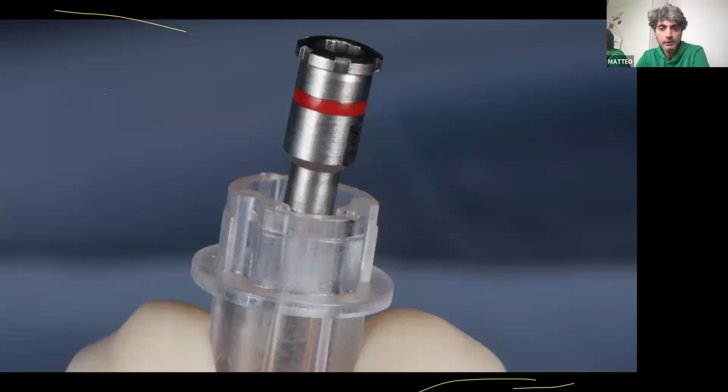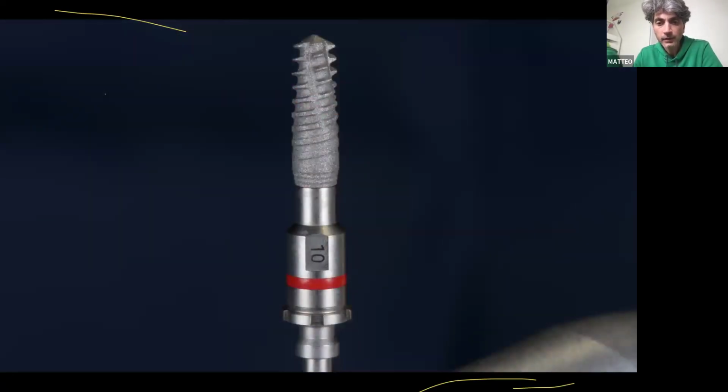Now, here we're using the stabilizer. So you put the stabilizer, you catch the implant, and then you have to screw. There's a screw inside. You need a screwdriver, screw, and then you have to connect the mounter to the handpiece and catch the stabilizer, which is screwed to the implant.